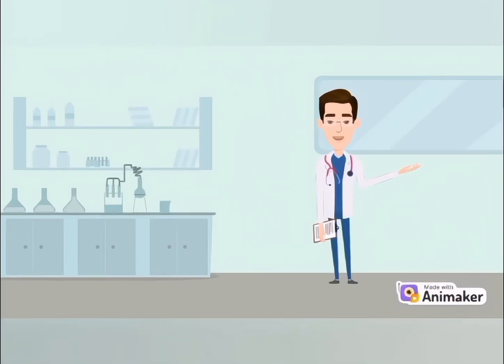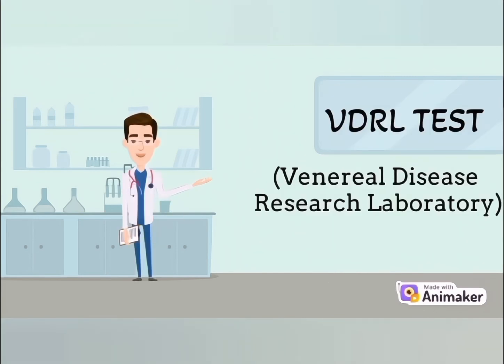Have you ever wondered how doctors test for certain infections, like syphilis? Meet the VDRL test, one of the most trusted methods to screen for this condition. The VDRL test, or Venereal Disease Research Laboratory test, is a simple blood test. It checks for antibodies produced in response to Treponema pallidum, the bacteria responsible for syphilis.